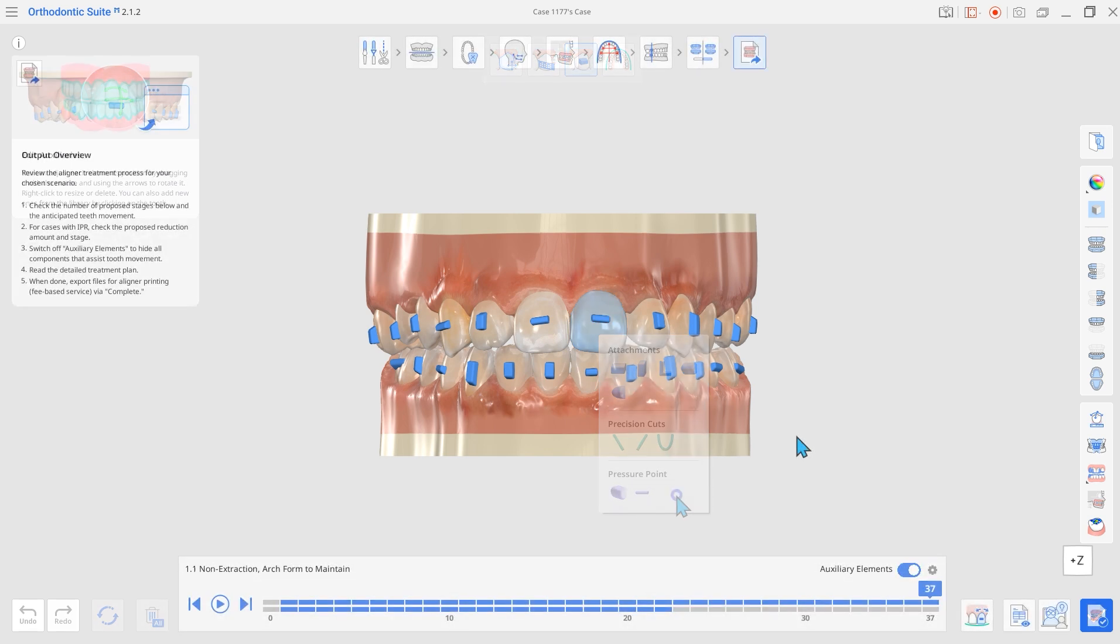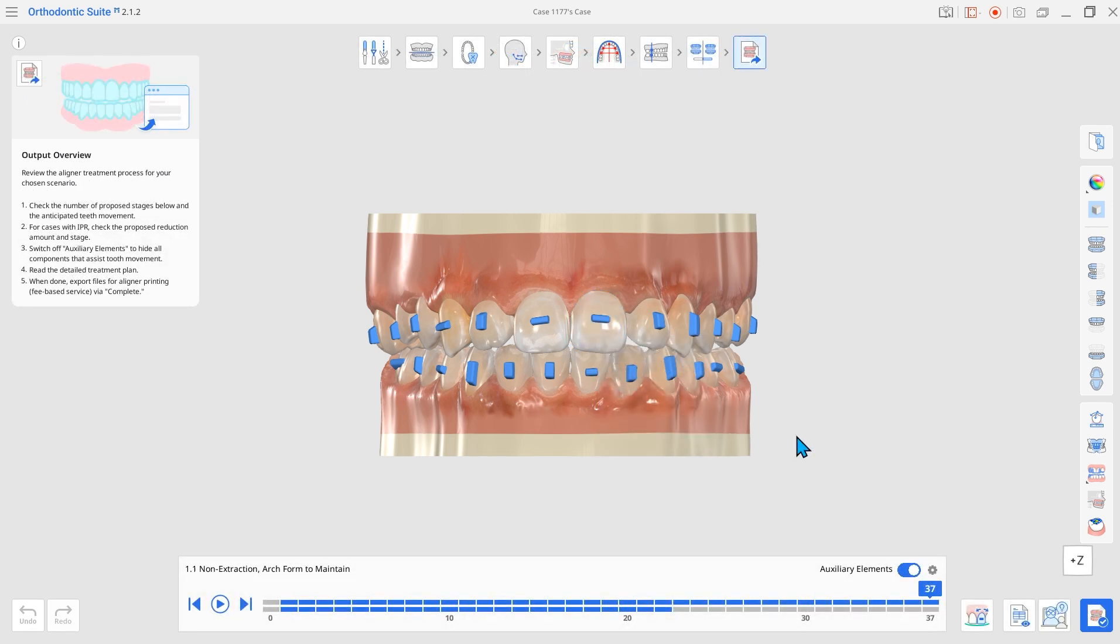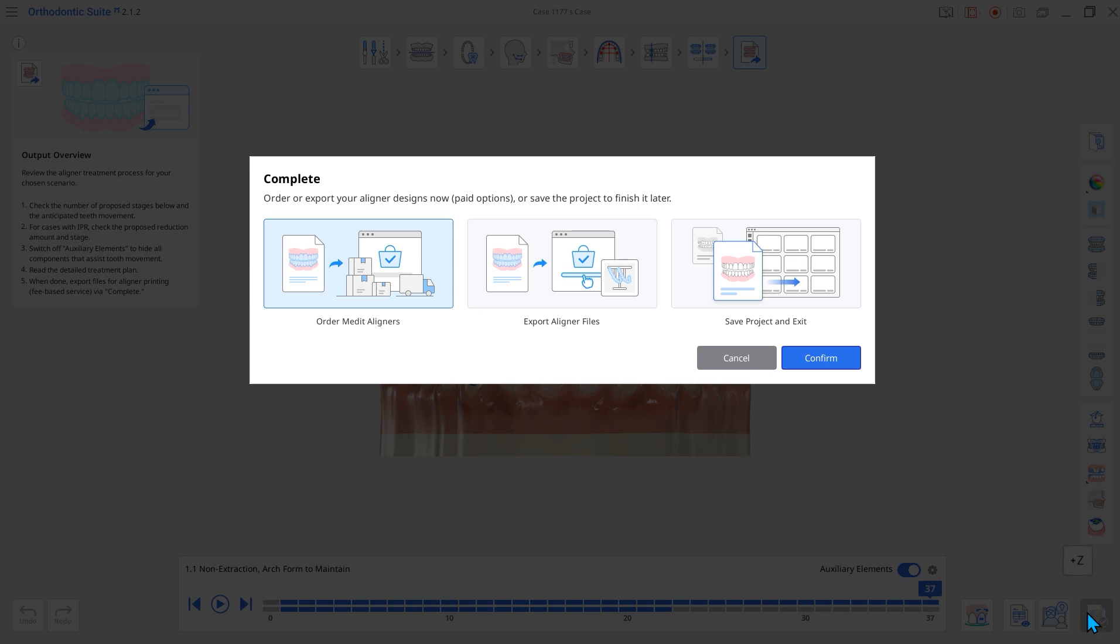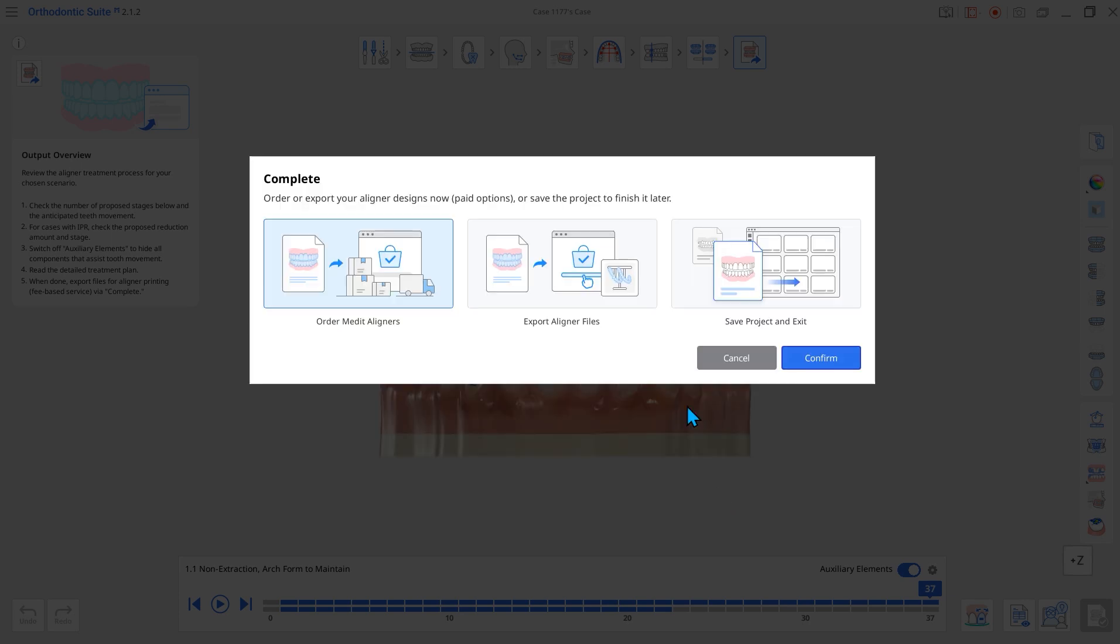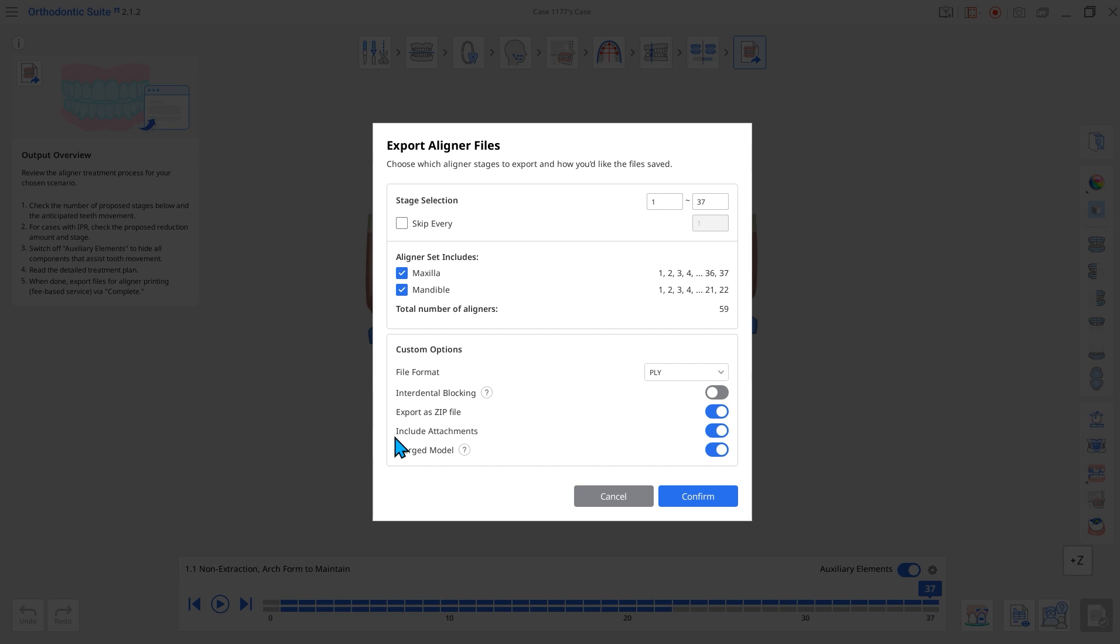Third, an option to include attachments has been added to the export window. In Order Medit aligners and export aligner files, you can now find a button to include attachments. The confirmation for attachment inclusion in the final production stage enhances workflow convenience.